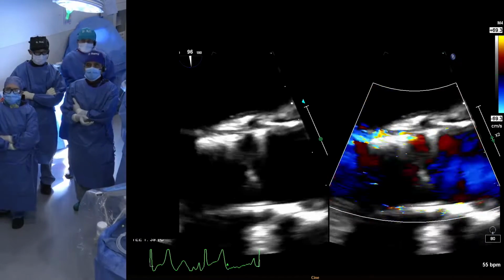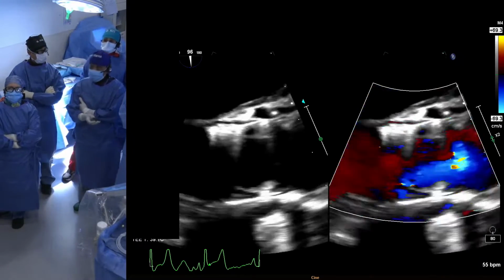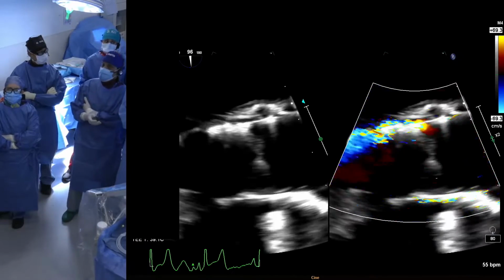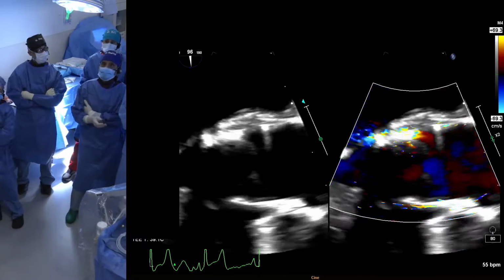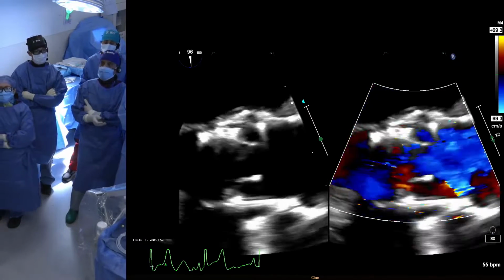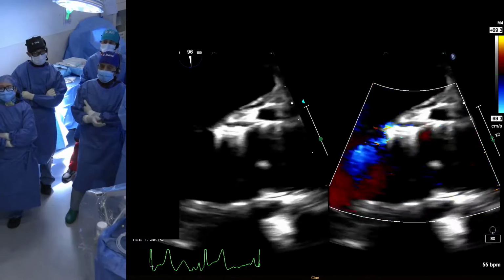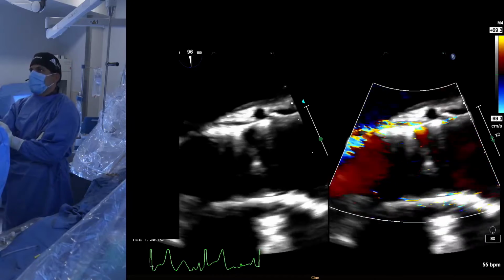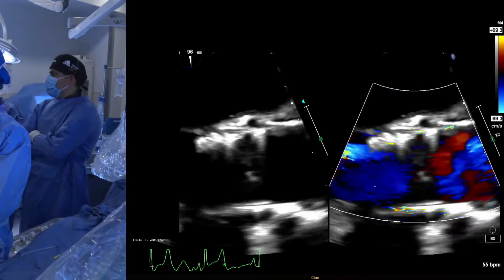I think this is a very classic example of a nominally expanded valve in a large annulus. This is what appears to me. And what happens in these patients who have persistent PVL is that the LV and LVOT tend to dilate. So initially you had mild PVL, and now this patient comes with moderate to severe. You have recoil in the valve, and you have the LVOT, which is persistently dilating, although a little bit, and it causes more PVL. So that's what I think is going on.